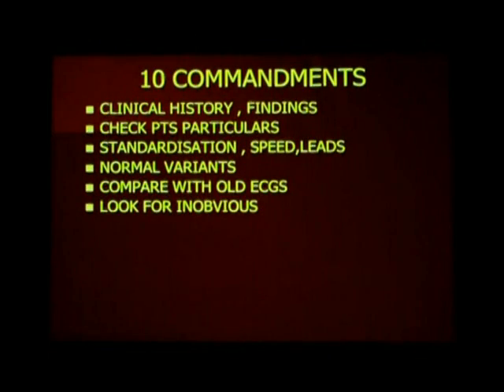So the good rule to read an ECG is to see what others are likely to miss, and if you diagnose what others are missing, you will become great in ECG reading. So obvious is obvious. Always look for the inobvious.